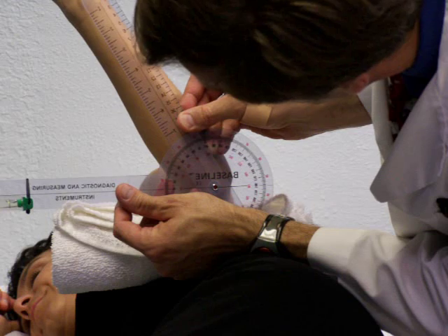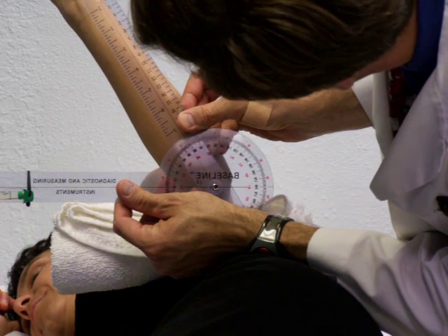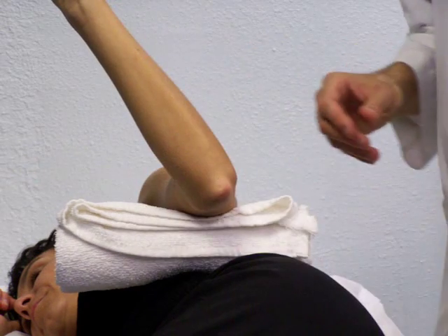We're going to find that angle. Make sure we're level. We're at about 58 degrees.